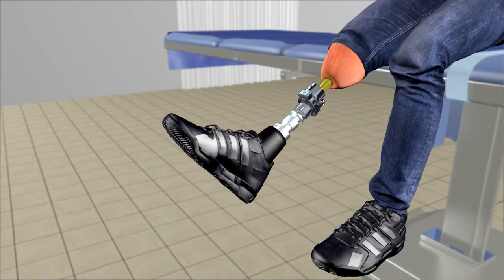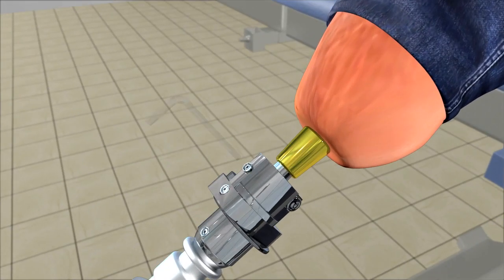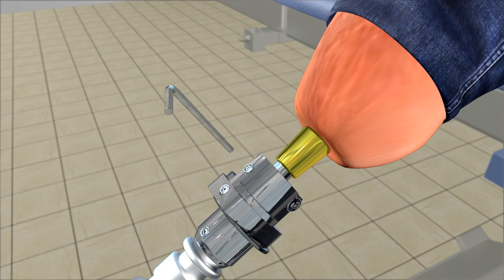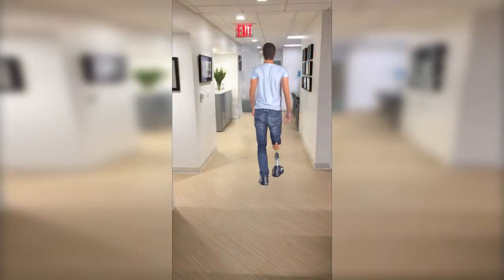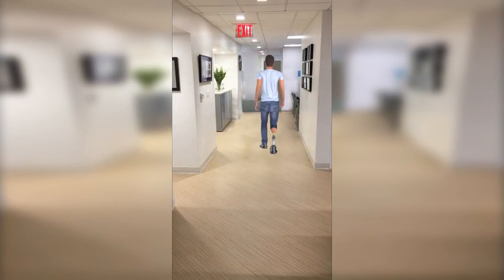First ambulation is started with two crutches and then transitioned to full weight bearing. Connection of the prosthetic leg to the abutment is rather simple. In my experience, patients have been weight bearing completely without assistance after about three months.